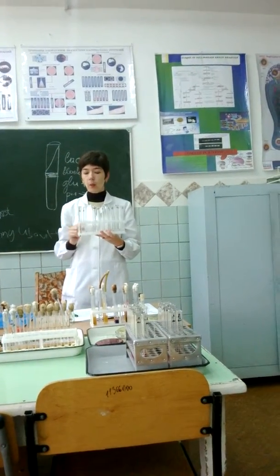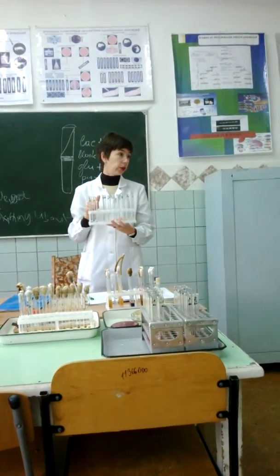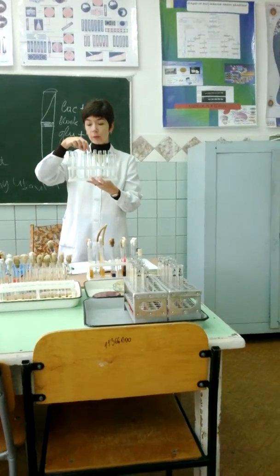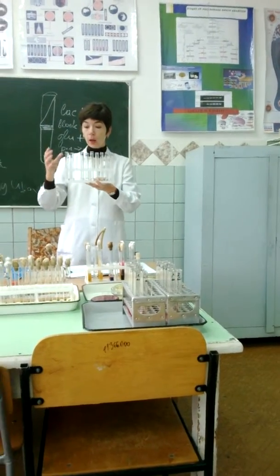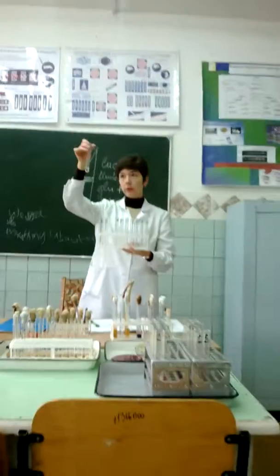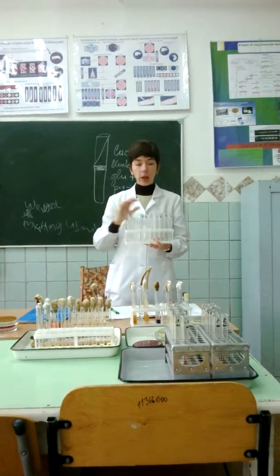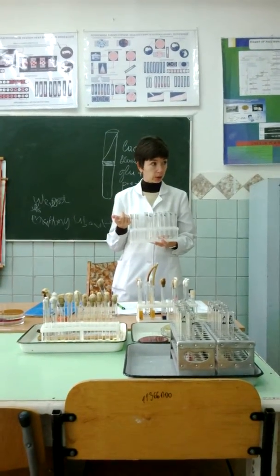Then we add to each of these dilutions antigens, a standard prepared antigen called diagnosticum. We also prepare control serum, only serum and saline solution, and control antigens, only diagnosticum and saline solution. And wait 2 hours. After 2 hours, we may read the first result.